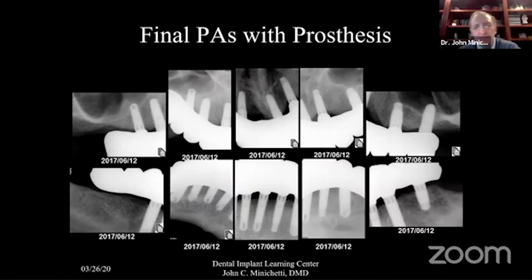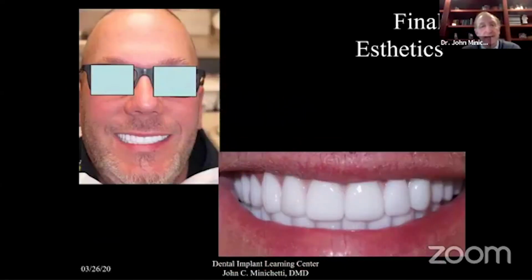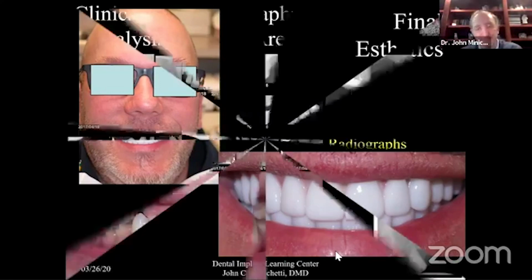But for this type of prosthesis, you understand the transition line needs to be reduced if it's not low already. Fortunately, his was low already. We did some reduction on his lowers, but with the perio, it wasn't as daunting. And the aesthetics he wanted was this full white aesthetic type of case. So this is what the patient that we're presented with has in her mind. She wants this white, perfect smile like her husband's.